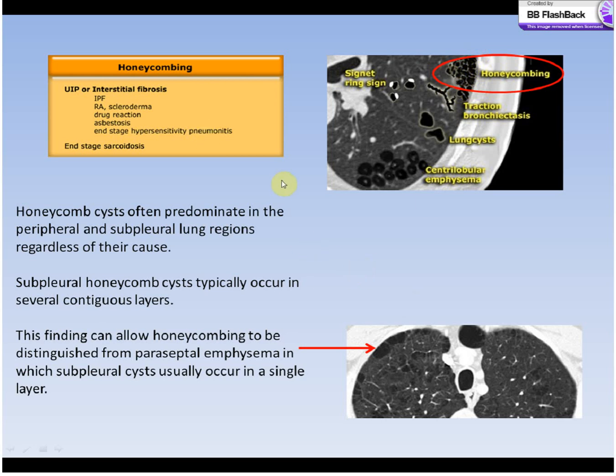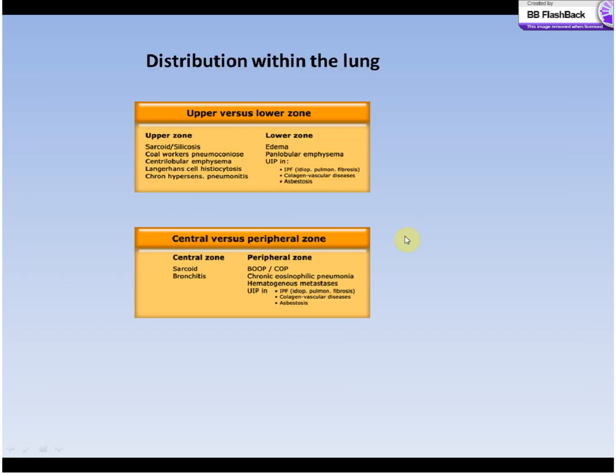The differential is very much related to interstitial lung disease and some of the idiopathic lung diseases that are chronic or progressive or end stage. So IPF, connective tissue disease related ILDs, drug related ILDs, occupational related ILDs, and end stage hypersensitivity pneumonitis, as well as end stage sarcoidosis. They can all have this final common pathway: honeycombing, traction bronchiectasis, lung distortion. Okay.